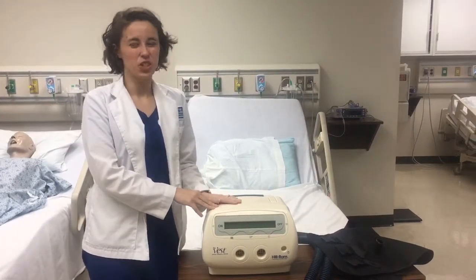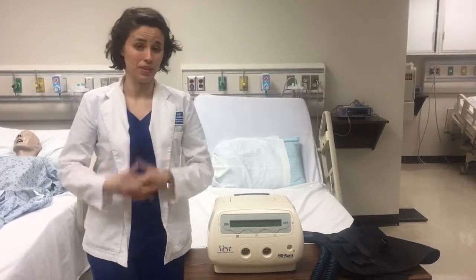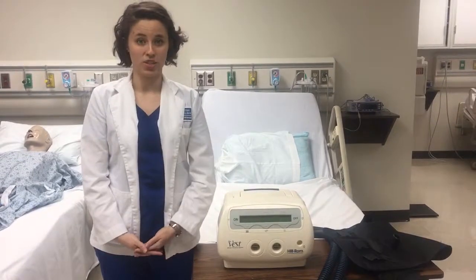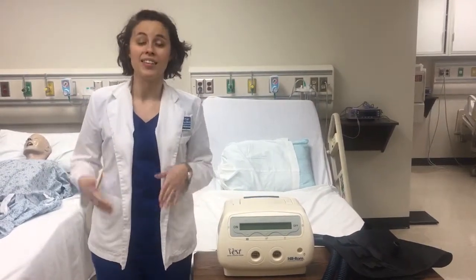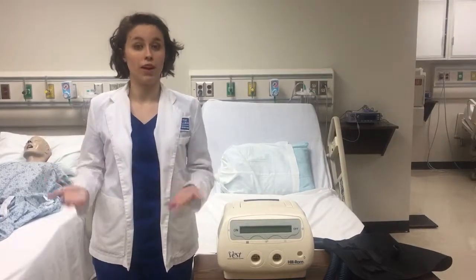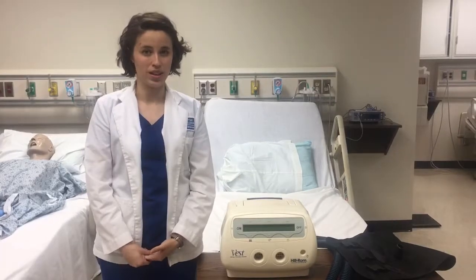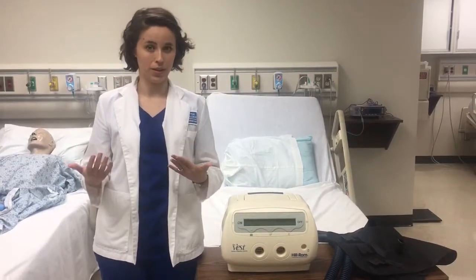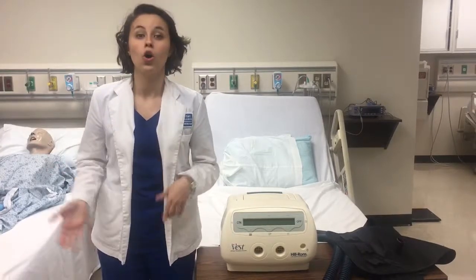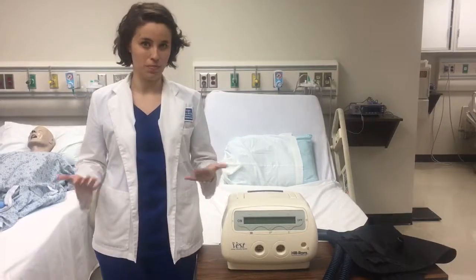High frequency chest wall oscillation devices have proven to have a variety of benefits. Cystic fibrosis patients have shown an improvement in their secretion movement as compared to other modalities of airway clearance therapy. Other populations also showed improvement as seen through their perception or how they felt that they were improving, through their actual outcomes or what the clinicians were measuring, and their compliance of the treatment.